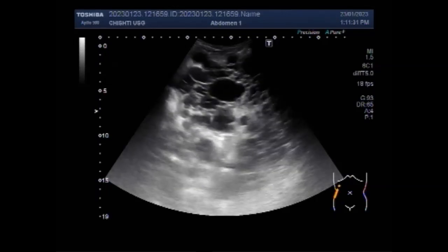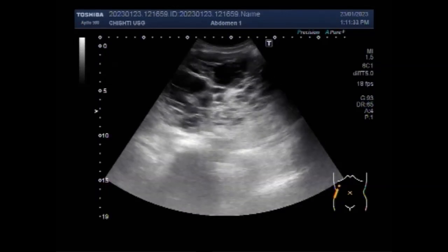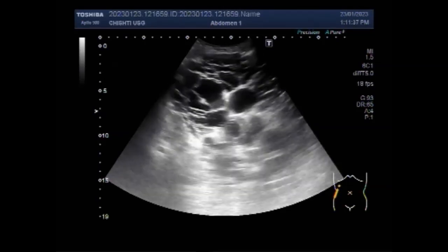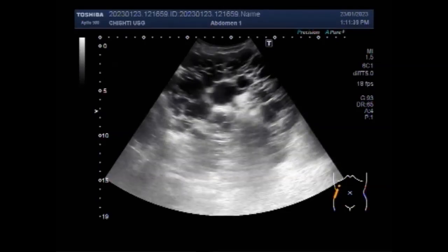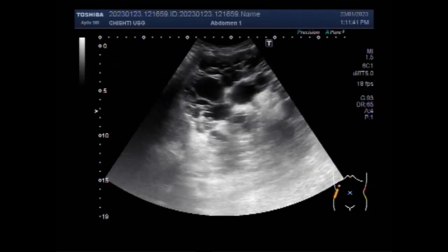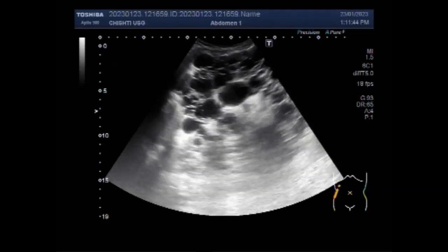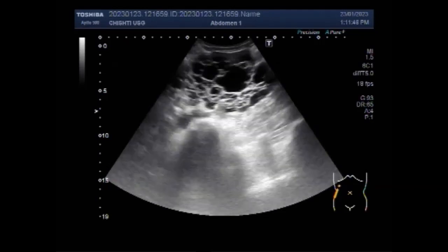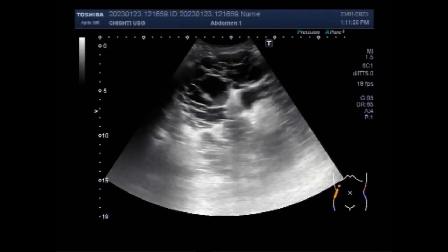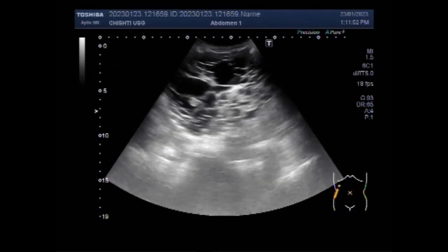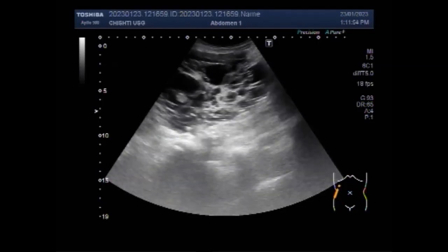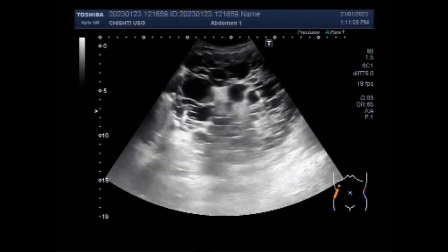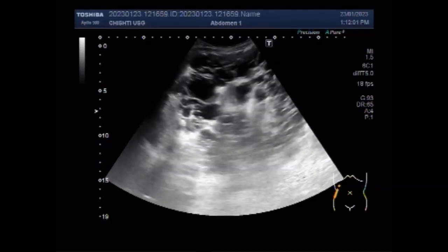This ultrasound video shows a case of autosomal dominant polycystic kidney disease (ADPKD) without any hepatic involvement. You can see the right kidney, which shows multiple cysts in the whole length of the renal parenchyma. The main characteristic in the kidneys is the presence of multiple cysts resulting from the dilatation of collecting ducts.